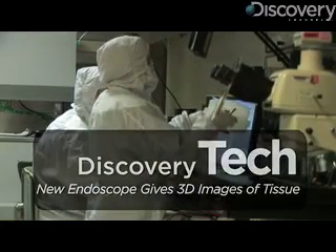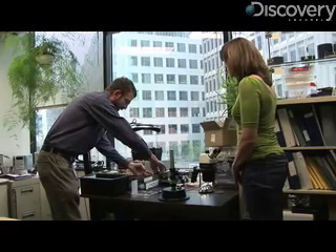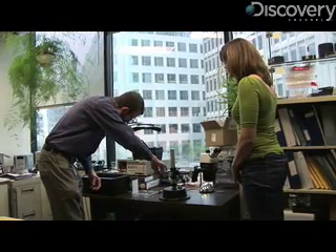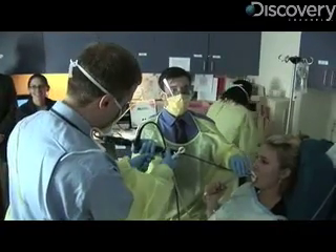Researchers at Draper Labs are taking a fresh look at how doctors find cancerous tissue. They're developing a new type of three-dimensional endoscope. Most endoscopes are just like TV cameras that go inside your body — there's either a little TV chip at the tip of the endoscope, or a bundle of fiber optics taking the image outside. But it's just looking at the surface of the tissue.